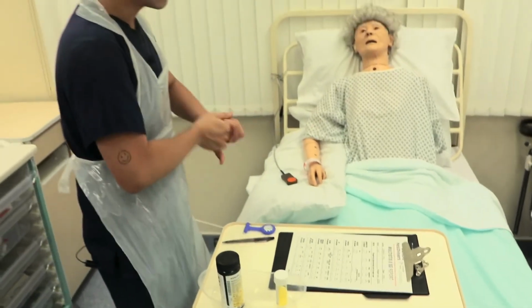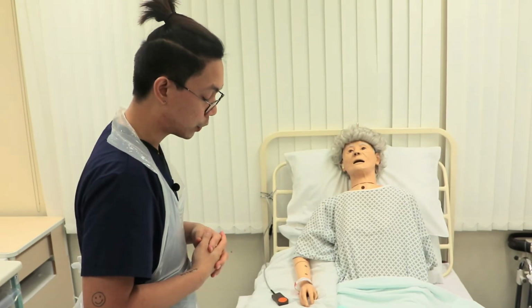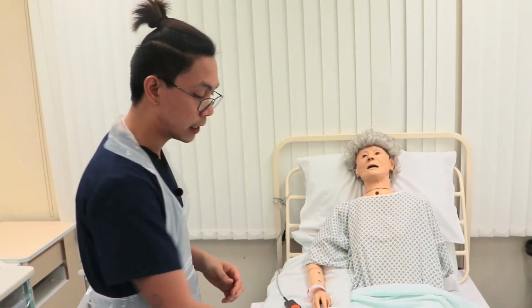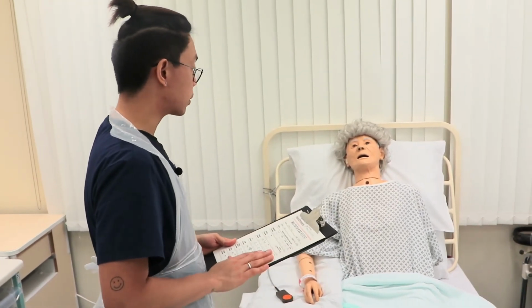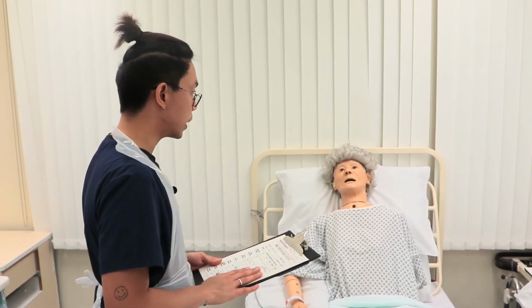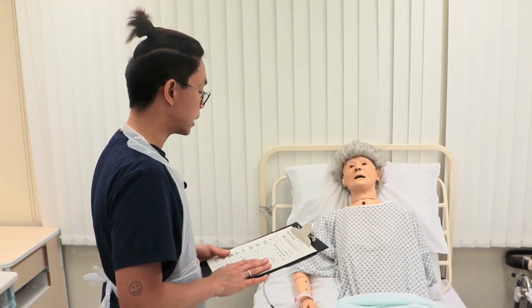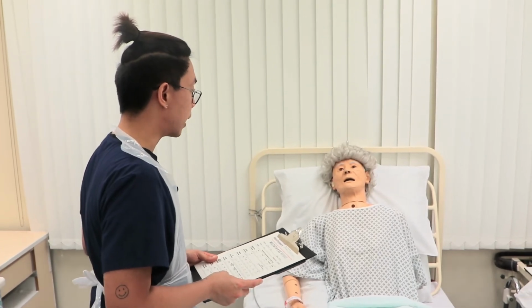Okay, so now Catherine, I've got here the results for your urinalysis. So based on your sample of urine, you've got 2 positive glucose in your urine and your specific gravity is 1.030. So what we're going to do is I'm going to escalate these results to your doctor and see if they will be updating your care plan. But for the meantime, what I need you to do is increase your fluid intake. If you could cut down your sugar and carbohydrates intake, do proper exercises if tolerated, and maintain your hygiene.